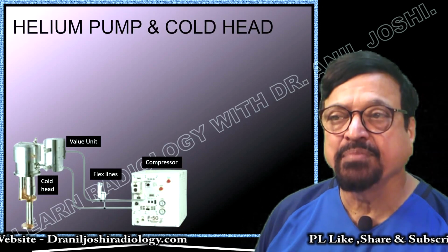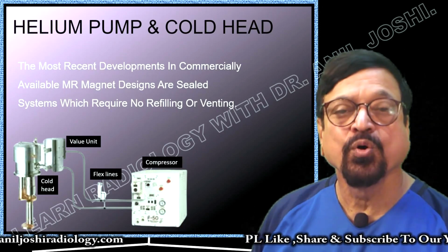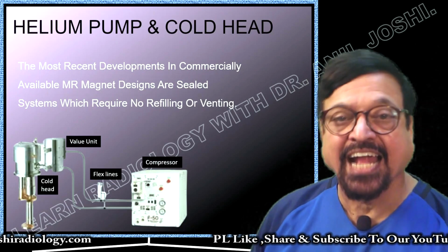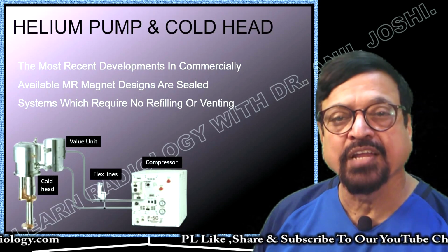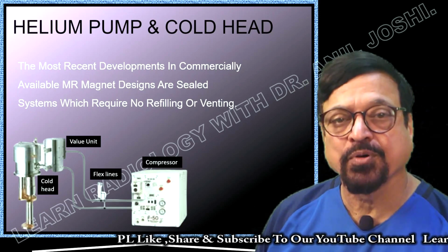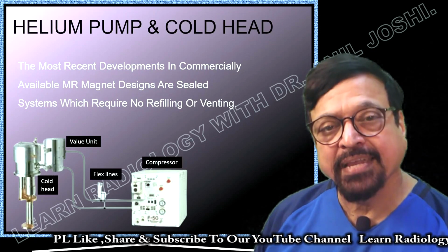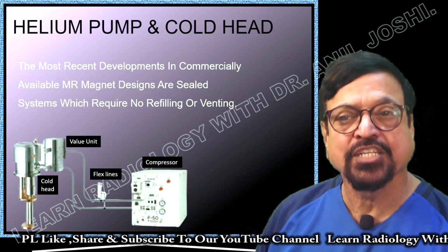Now these are the helium pump and cold heads which you are seeing here. Though both are essential, they work together to see that the helium is put into liquid form after absorbing heat from the superconducting magnets, making it liquid again at a temperature of -269.